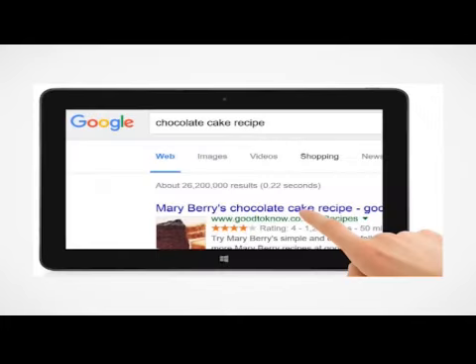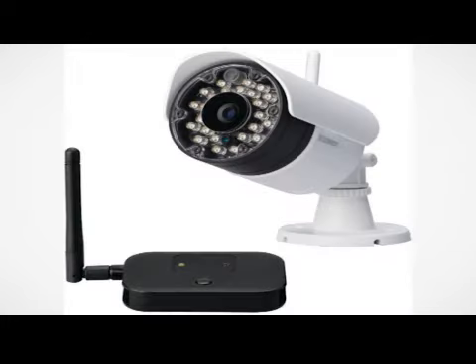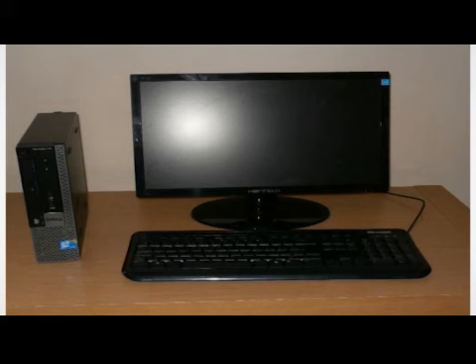Electronic devices. Electronic devices provide a high level of magnification, excellent contrast, and are useful for reading larger amounts of information. There are closed circuit television, handheld cameras, computer programs, and head-mounted systems that allow a variety of educational, recreational, and professional activities. Closed circuit television has a movable platform for a book or paper, a video camera with a zoom lens, and a large screen video display. It sets up a complete system on a desktop.